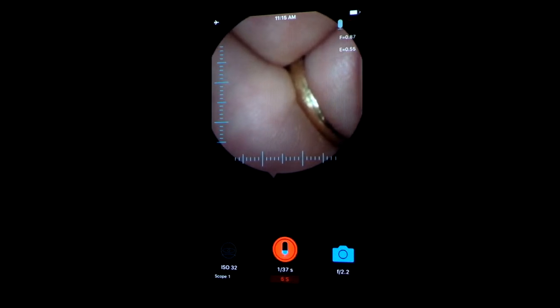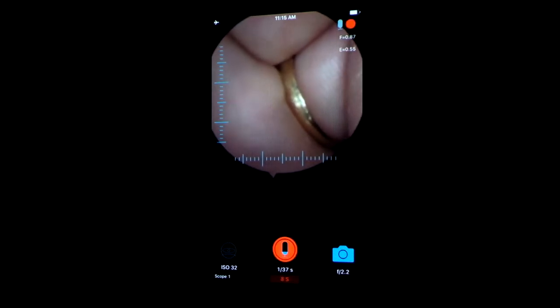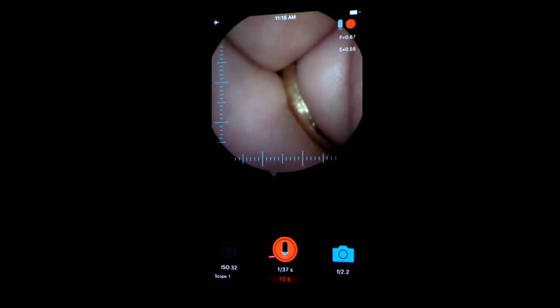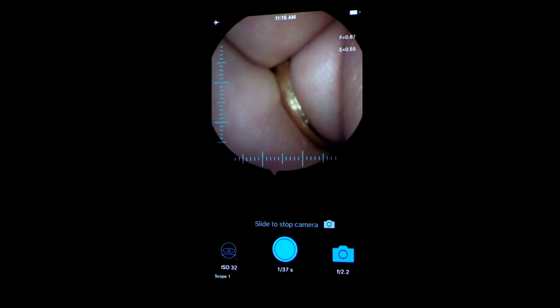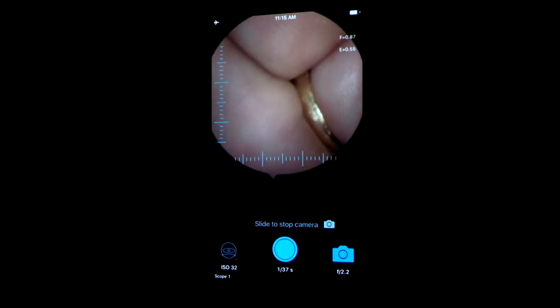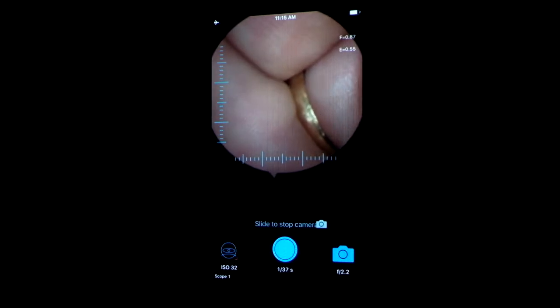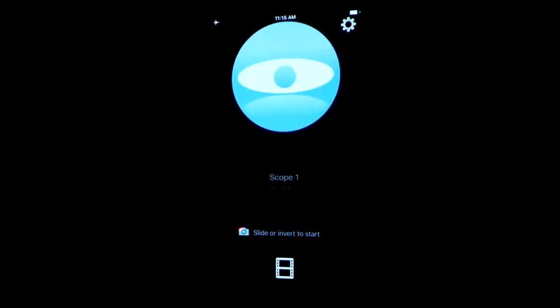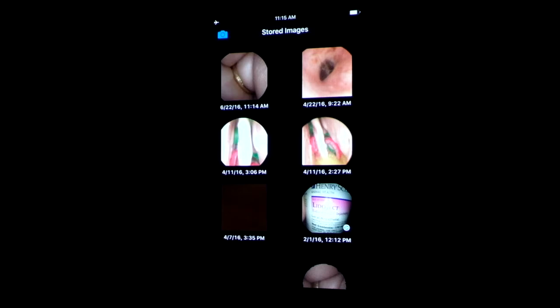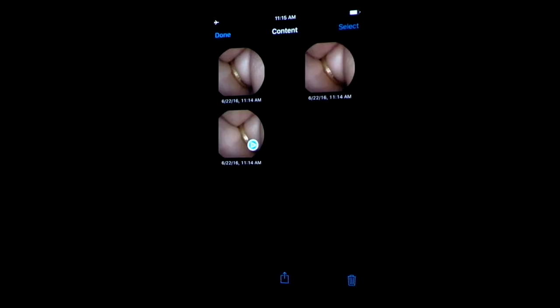If you tap and hold it, you'll get a microphone that comes up on the bottom of the screen, so now you're dictating while recording images. If you want to go back and be able to send those images to a client, simply slide the camera across the screen — that will take you to your home screen. Depress the film button at the bottom of the screen and that will take you into the images that were just captured.